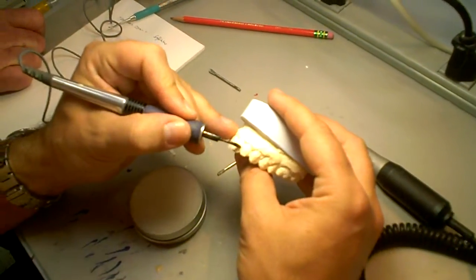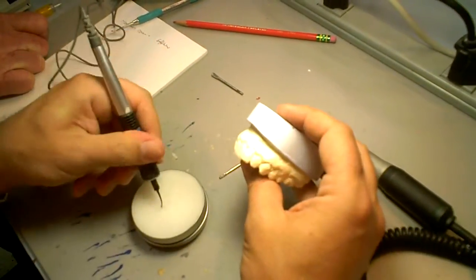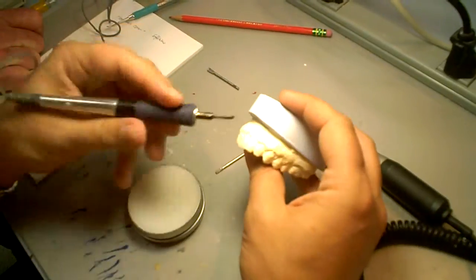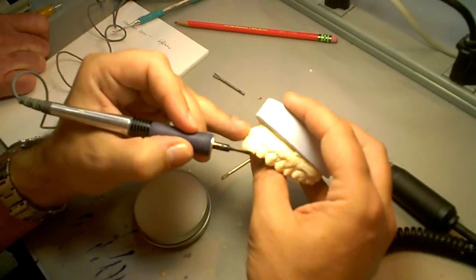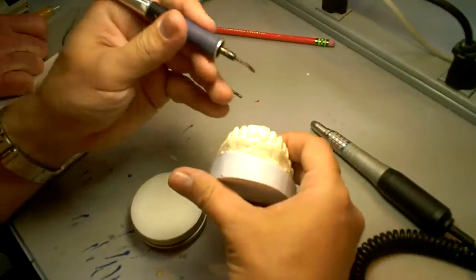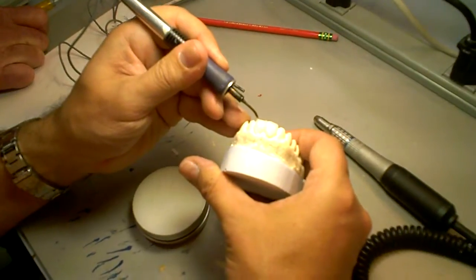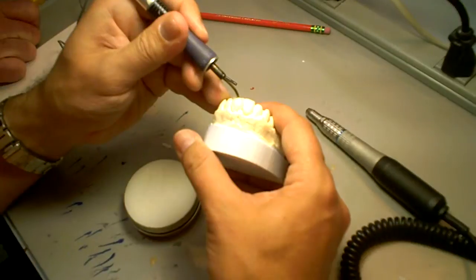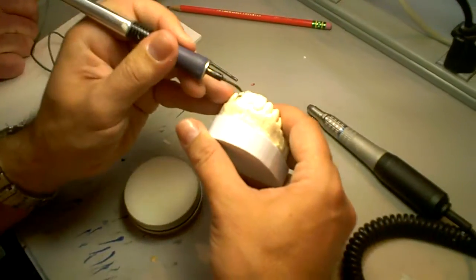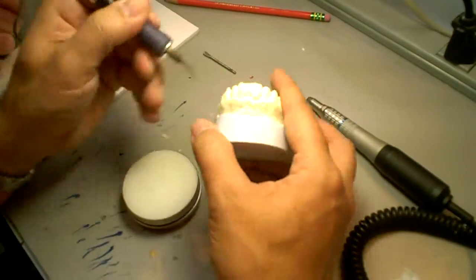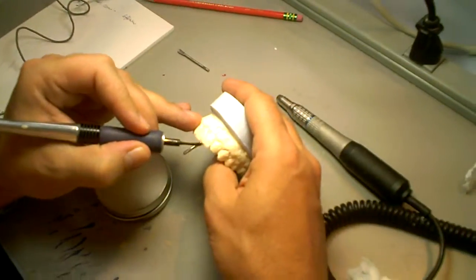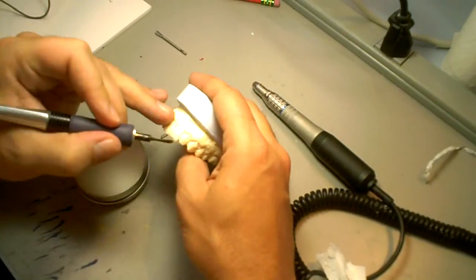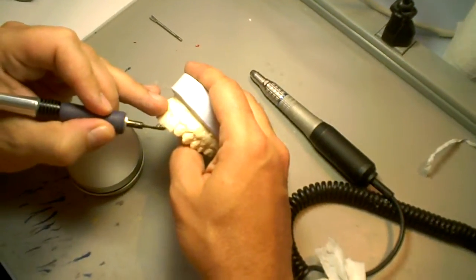So again, I'm building just a little outside of this tooth. And like I said, after these guys are done, the laterals are a piece of cake. Are the muffins ready? Yeah. Let me take them out of the first one.